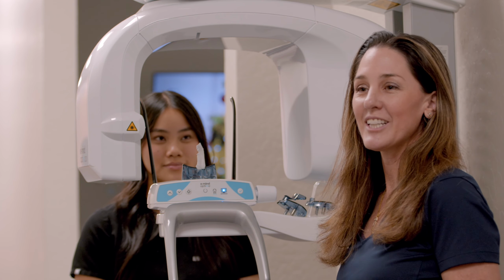Now I can make sure that she is both mid-sagittal and also her Frankfurt horizontal looks correct. So if you're okay, Vicki, I'm just gonna slide your hair to the side. What we're looking for here is kind of making sure that laser light is right at her Frankfurt horizontal. Looking for ala-tragus. We're gonna have a slight tilt of the chin. If we need to, we can just kind of drop Vicki down just a little bit so we get that nice slight tilt of the chin.